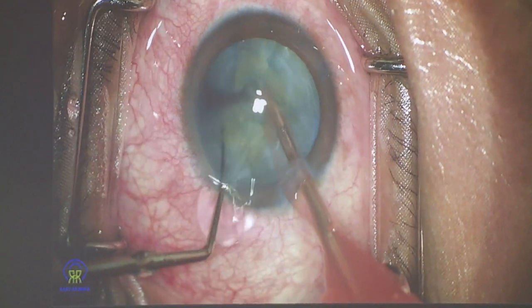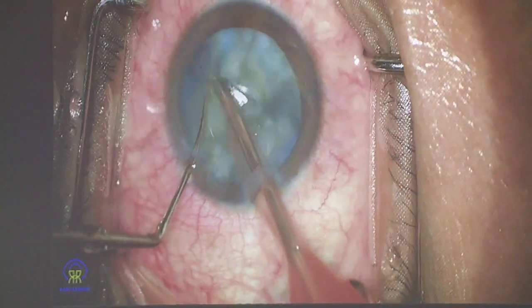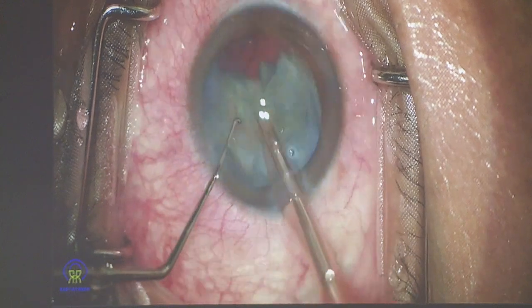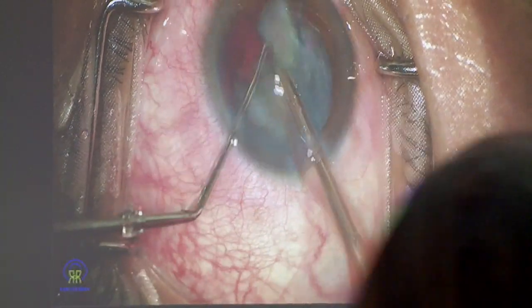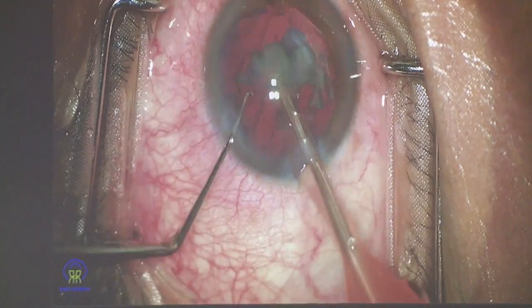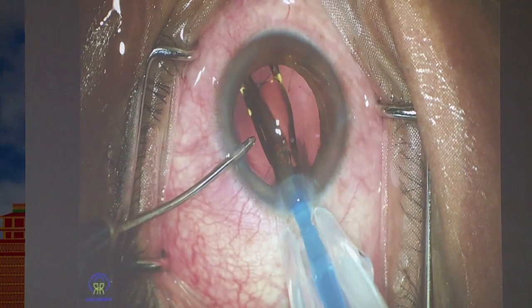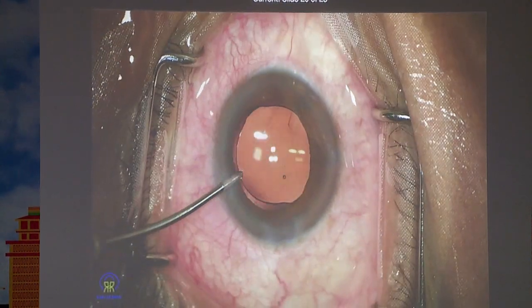And then I started operating on the case. Now, following the guidelines that's so beautifully lamented by Dr. Rohit, this flap was not extending to the PC, but the visualization was important because I was seeing where the flaps were exactly. I was seeing all along the posterior capsule beautifully. I knew that there has not been an extension. You can look at the view, it's unparalleled.